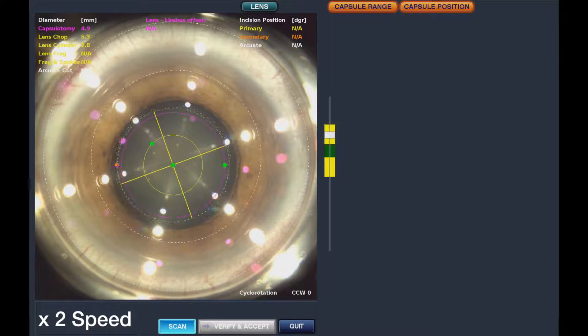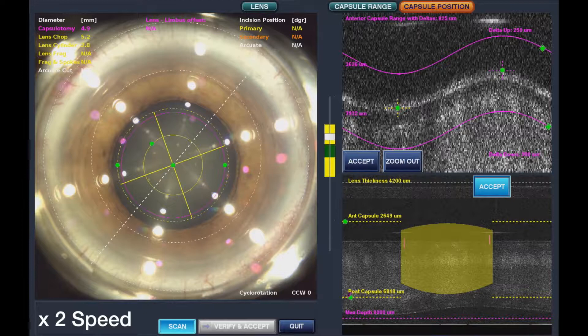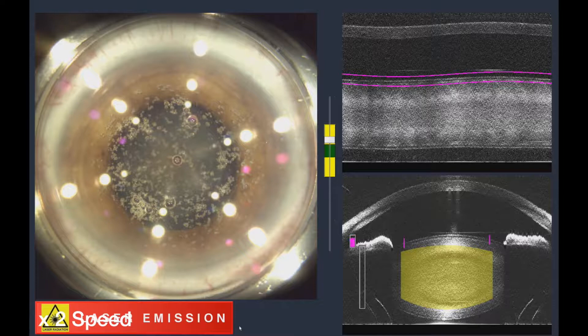Firstly, it performs the capsulotomy, so it opens up the lens, and secondly, it breaks the lens into tiny little pieces. There you can see the capsulotomy being formed, and there is the lens being broken up into little pieces.